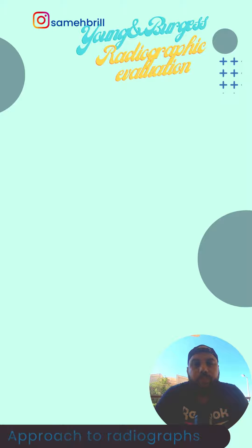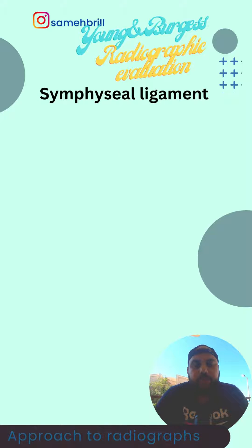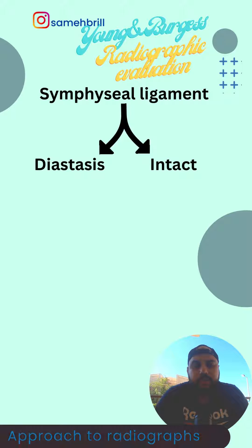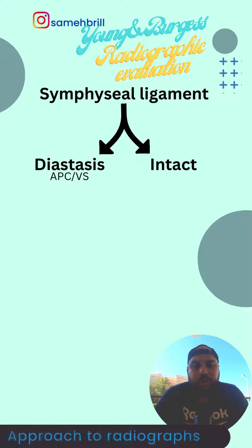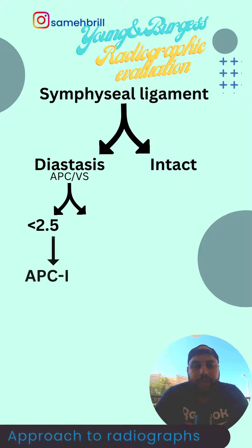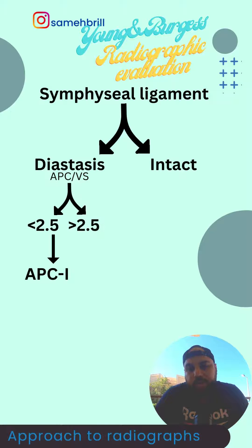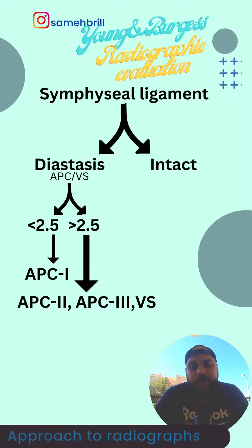I start my approach with the symphysial ligaments or symphysial diastasis. If there is disruption of the symphysial ligaments, that might be an APC fracture or even a vertical shear. If the diastasis is less than 2.5 cm, that will be an APC1. If the diastasis is more than 2.5 cm, that might be an APC2, an APC3, or a VS.